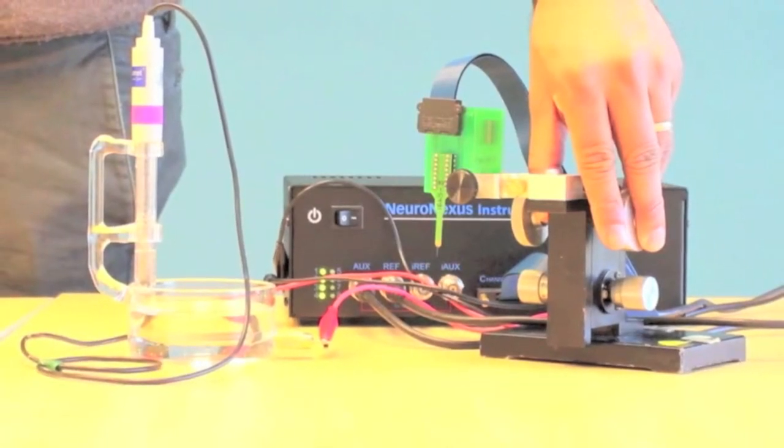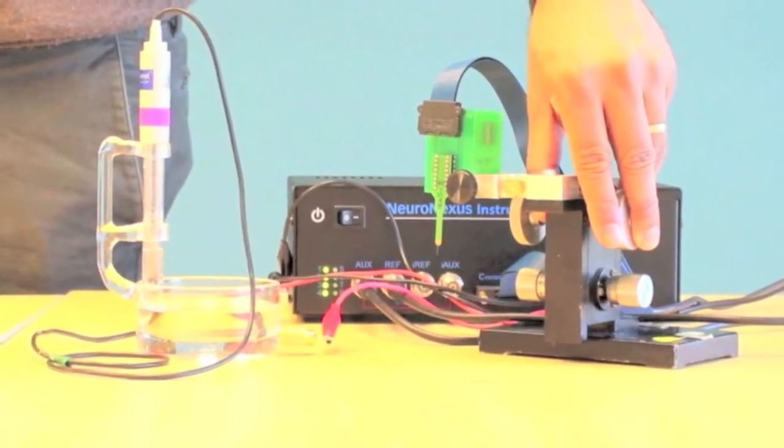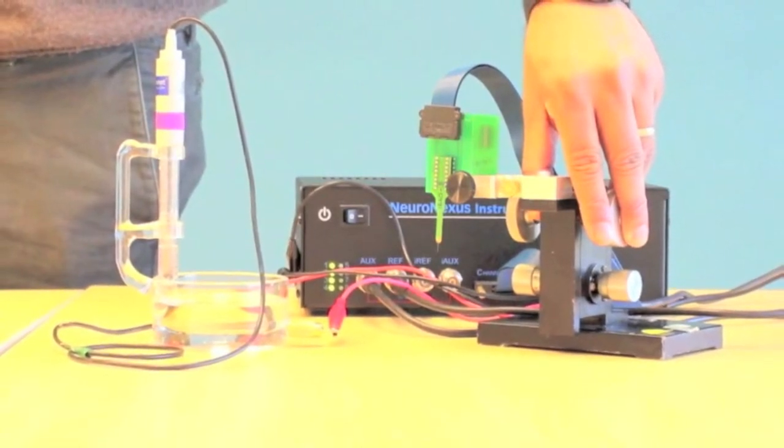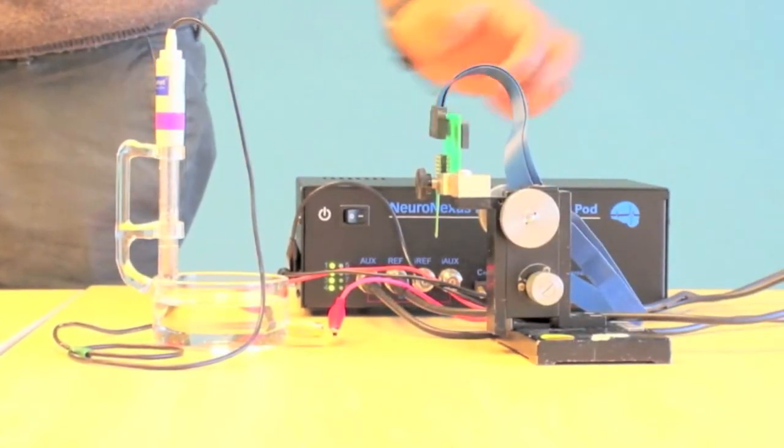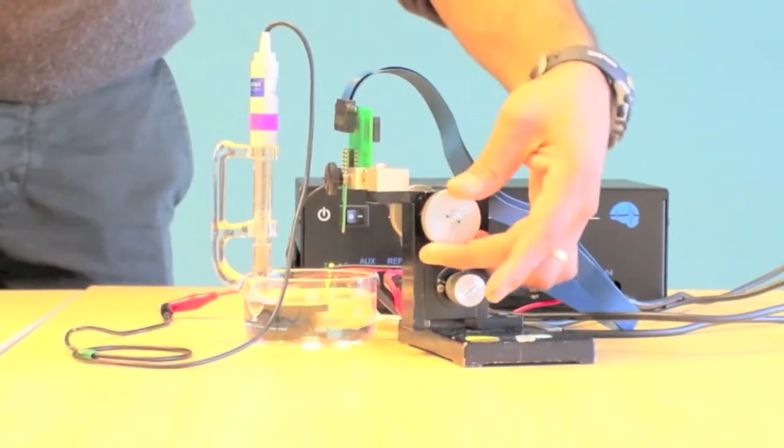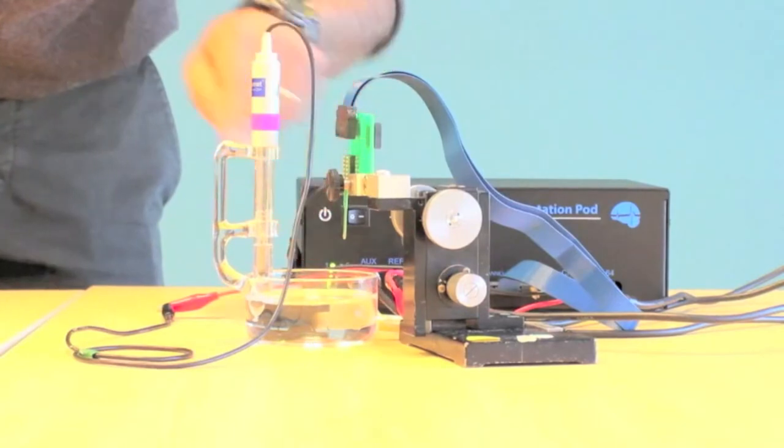Fill the glass dish with electrolyte solution. Neuronexus recommends using 0.1x PBS. Connect the blue cable to the probe adapter and plug in the probe. You may mount the adapter to a manipulator to lower the probe into the dish and you're ready to begin.